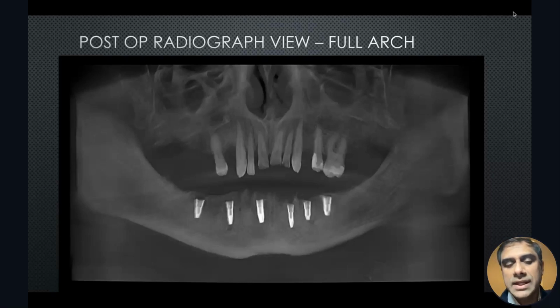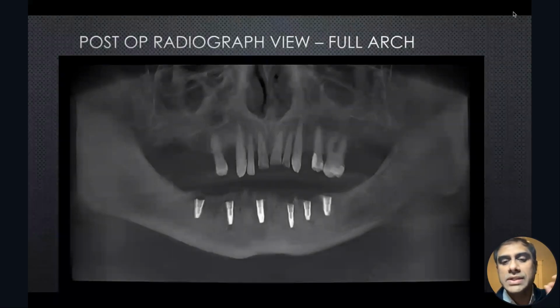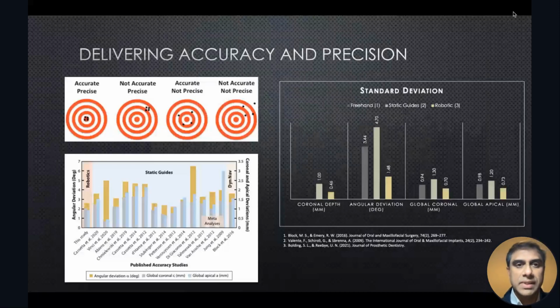you actually look at the plan on the sagittal view, I'm actually 3 millimeters away from all the necessary nerves, because when I've done the nerve mapping on the software, I'm making sure that I'm well secured and not dangerously close to those nerves. Next, please. And this literally took about 15 minutes to place all those implants.